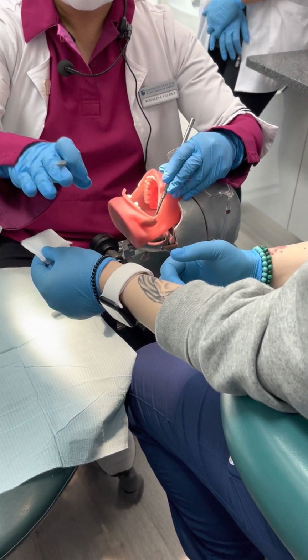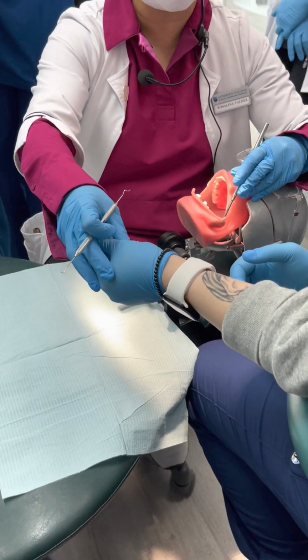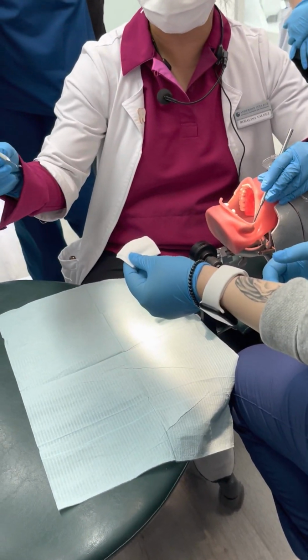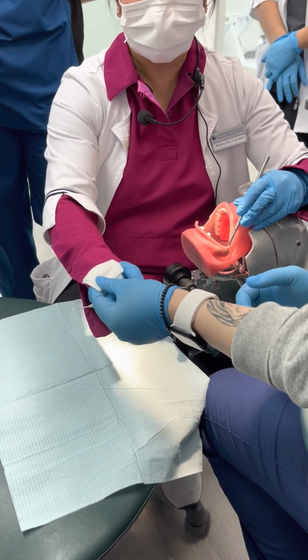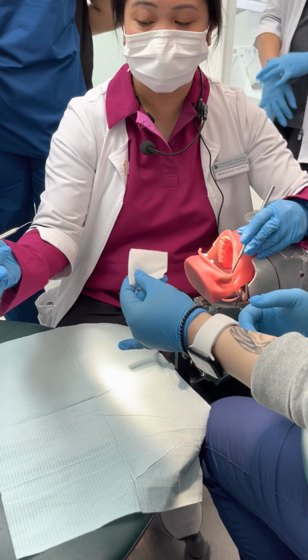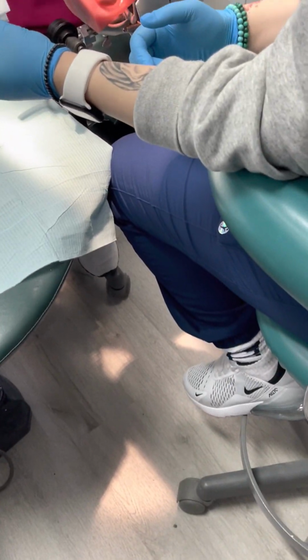Okay. So this is your passing hand. If I'm a right-handed dentist, your left hand is your passing hand. Okay, passing hand and receiving hand. This is your passing finger and receiving fingers. Open your finger. Hold it there. Open, like this. Or you want one, either one or two. Doesn't matter. Whatever is easier for you.